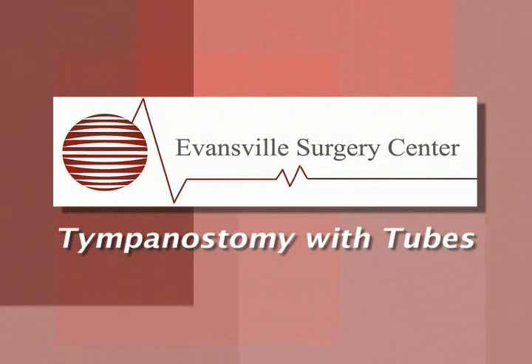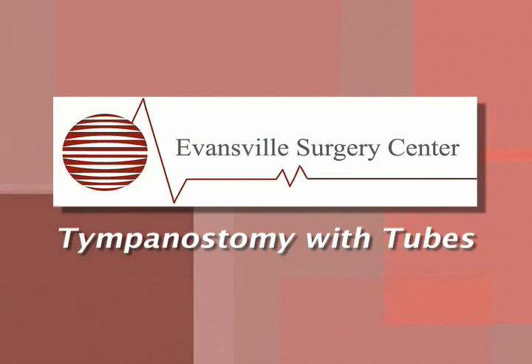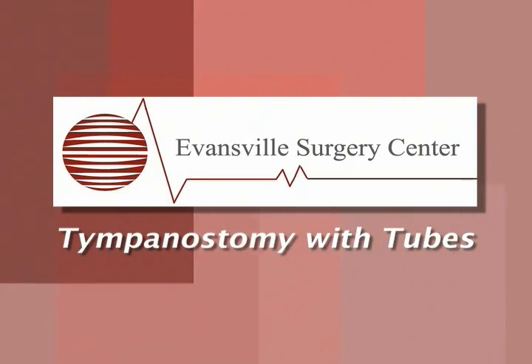Hello, today we're going to be discussing placement of tympanostomy tubes for recurrent ear infections. The patient is brought to the facility, which is usually an outpatient facility, and is taken back to the operating room with an anesthesiologist and accompanied often by a nurse. At that point, the surgeon meets the patient and the other healthcare providers in the room.